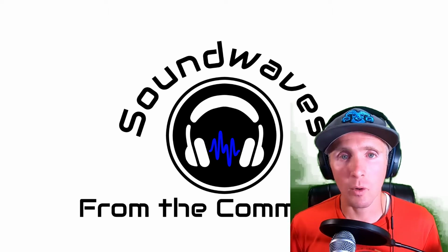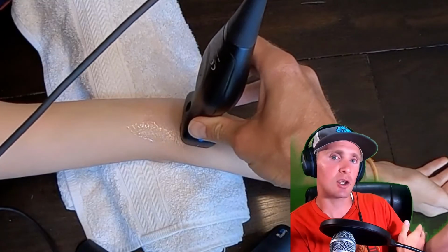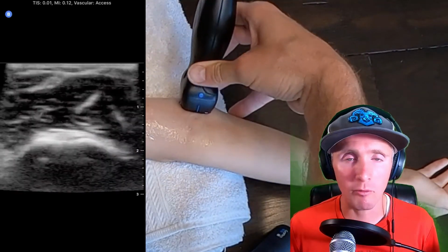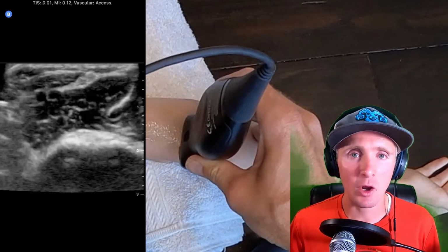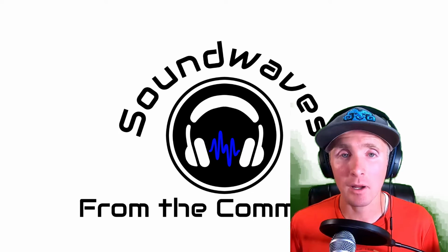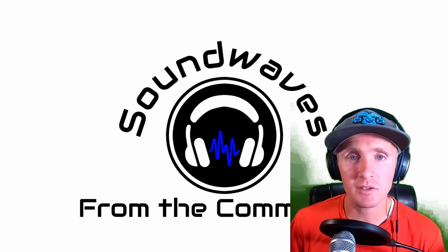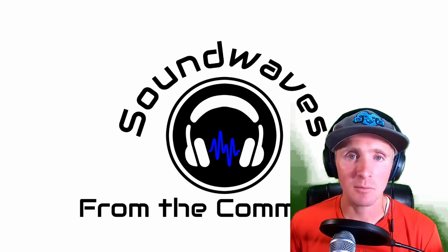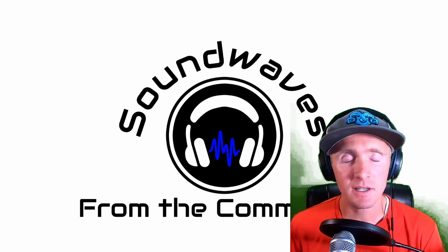And to acquire the image, I usually go right around the antecubital fossa, look for the veins that you would typically go for anyways, and just slide side to side until you find some anechoic circular structures. So you're going to be doing a short axis view, and I would recommend a short axis or out of plane approach for most of these, just because the veins are so small and tortuous. It's difficult to do an in plane or long axis approach with ultrasound guided vascular access.